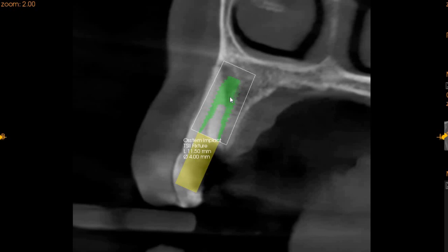We can see that if the implant is placed more palatally, there will be more engagement at the apical and palatal segment. Grafting will need to be done and it will need to be seen if the buccal cortical plate survives the extraction, or a socket shield method can also be applied in such a case.